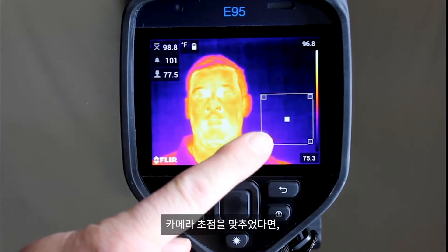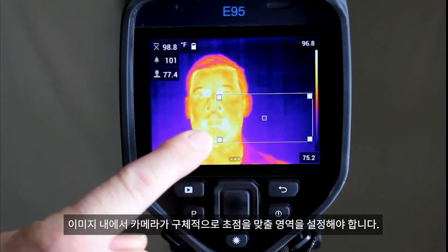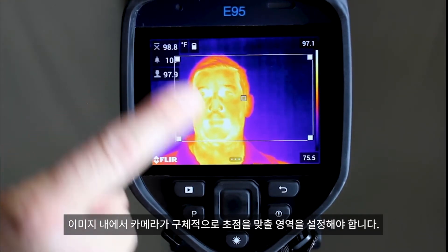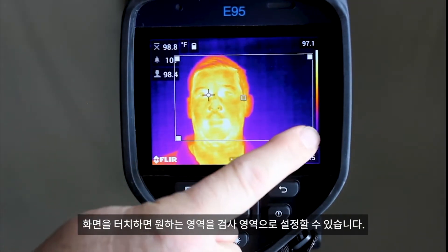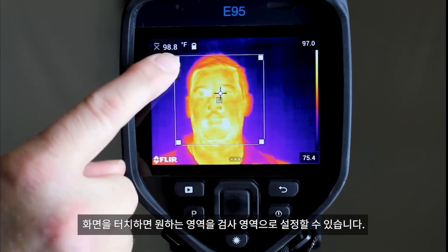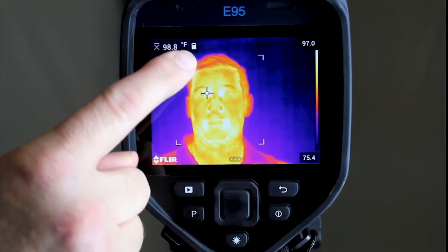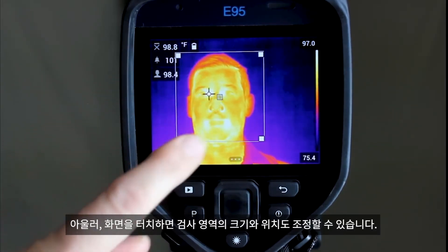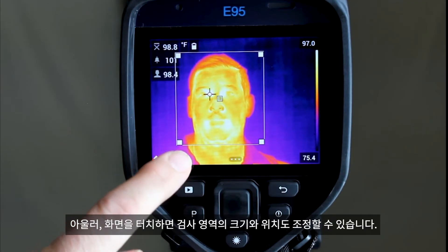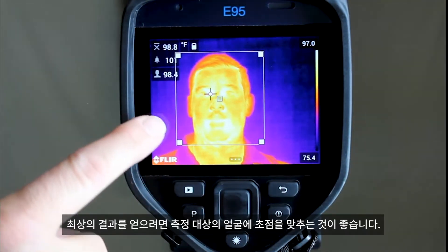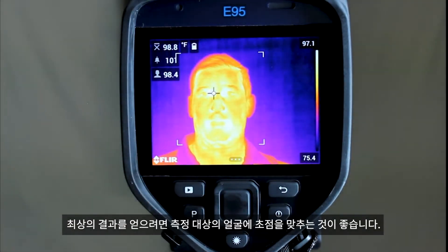Once the camera is in focus, we will need to set the area within the image where we will focus on. This can be done by touching the screen within the screening area. This will now allow you to move and resize the screening area. For best results, you should focus on the face of the subject.